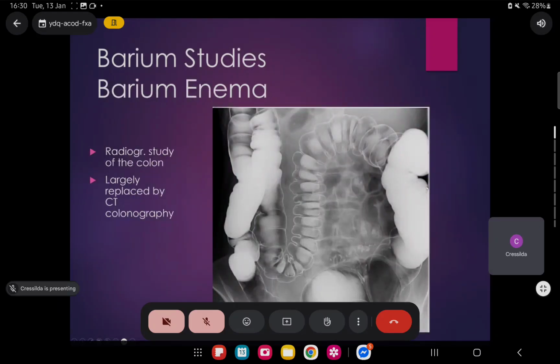All right. Then barium enema, or now we just call it an enema study. You could have a single or a double contrast, but almost always we do a double contrast. So we would first give the contrast material. We would fill the colon up to the ileocecal junction. So that would be somewhere, oh, this is the other way around. Okay, it would be somewhere here. Yes. So when we see that it has already reached that portion, if the patient is normal, that's when we would stop. We would drain everything.